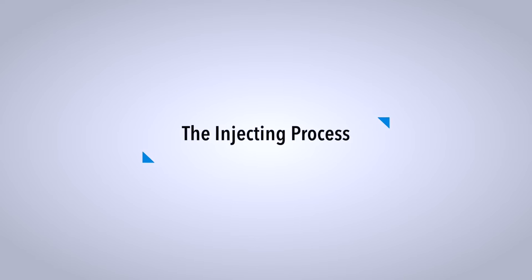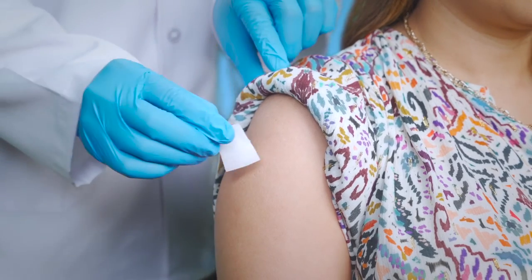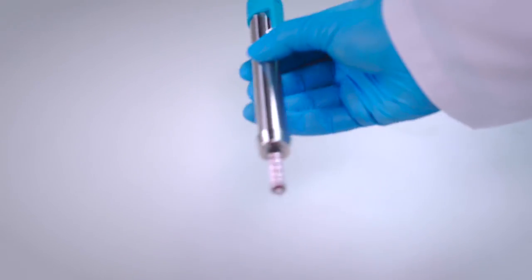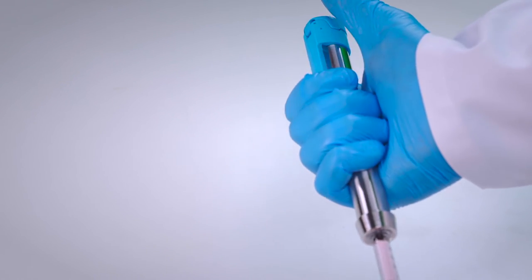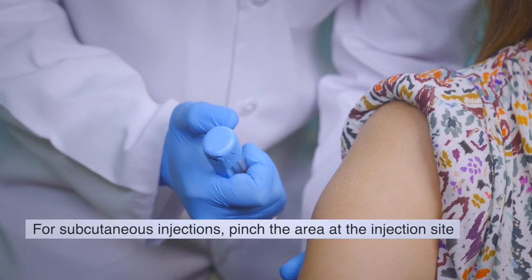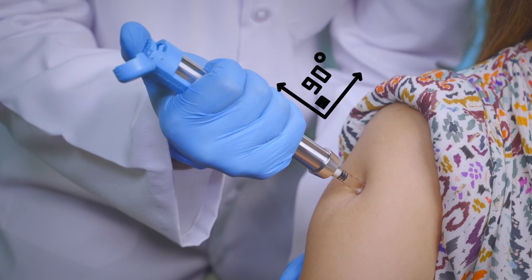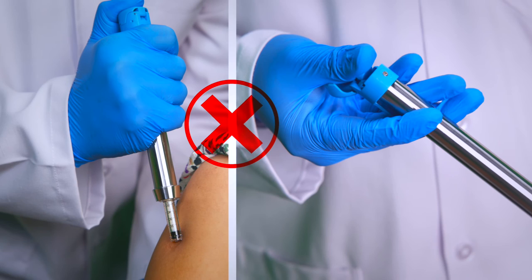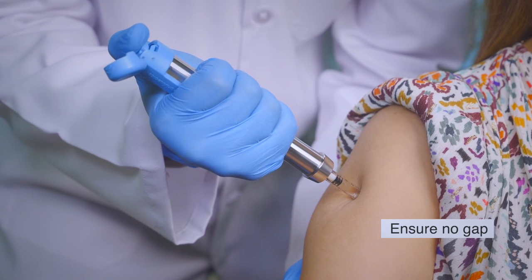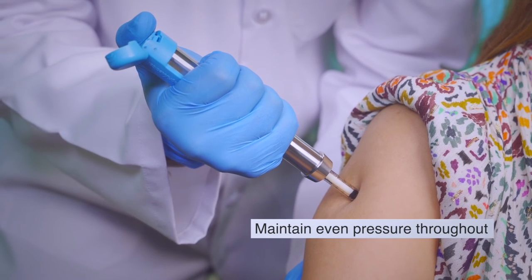The injecting process. Ensure the patient is in a comfortable position, either sitting or lying down. Clean the injection site with an alcohol swab and let it dry completely. Hold the NFIS device firmly between your palm and fingers in a thumbs up position, and hold the patient's arm firmly from the other side. Open the safety cap on the NFIS device. Position the device at a 90 degree angle to the injection site — do not hold it at any other angle to avoid spillage. Apply soft, even pressure to ensure no gap, then firmly press the trigger button and maintain the position until the entire medication is administered and thereafter for a few seconds.